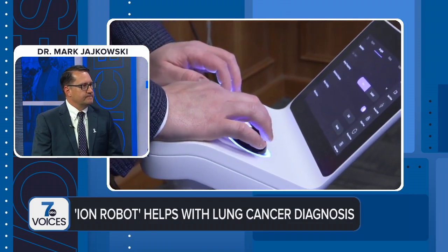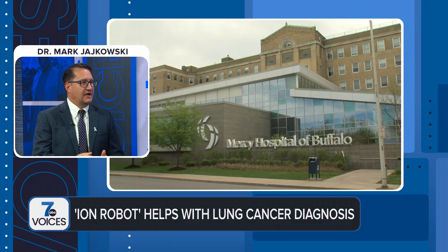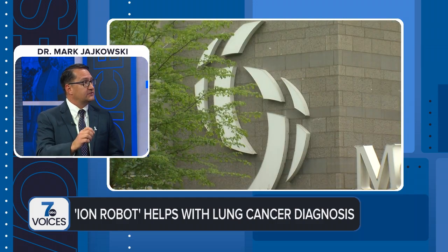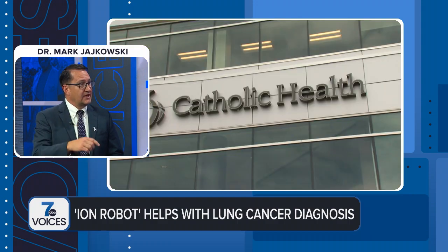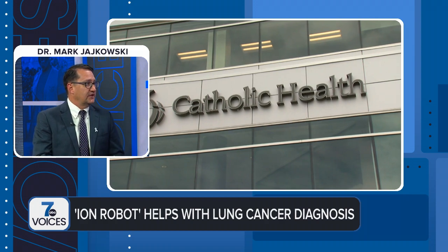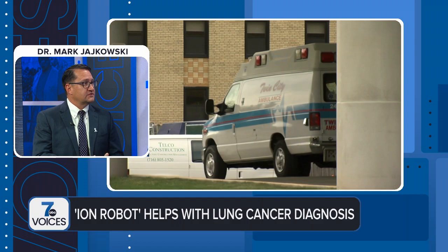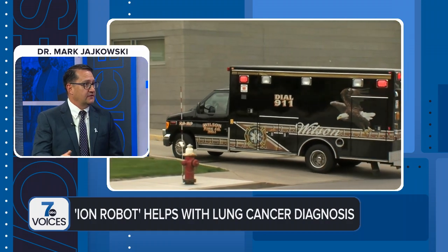Wow. And the whole point of that is you want to be as minimally invasive as possible, right? I read when I was looking into the device that it also gives you quicker and it sounds like better, more detailed results. Is that right? Yeah, by going from inside, you have less risk of complications from taking samples, because the other way to do that would be from putting a needle from outside the lung inward, actually poking a hole in the lung. So going from inside gives you a little less risk of potential complications, but also by bronchoscopy at the same setting, we're able to also assess patients' lymph node status if they do have a lung cancer, which is important for staging purposes and directing the next steps in care.